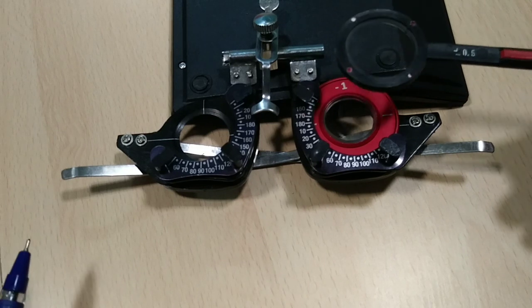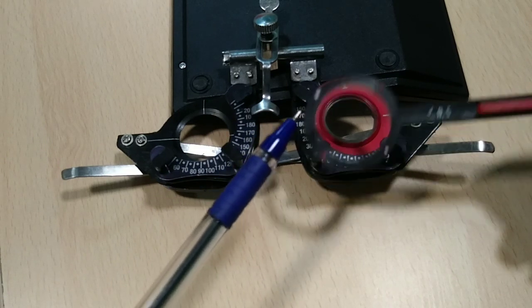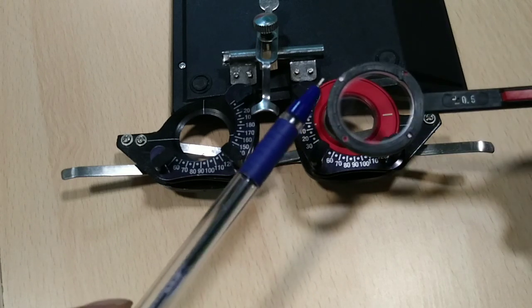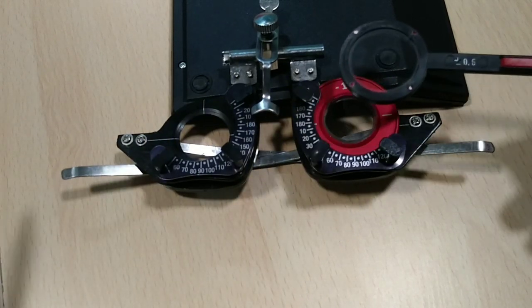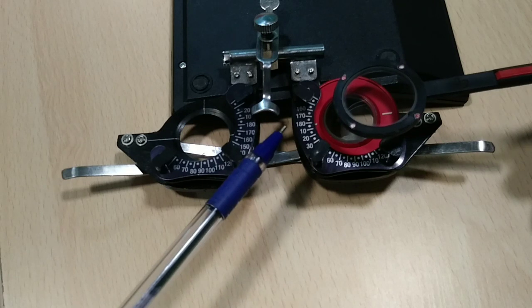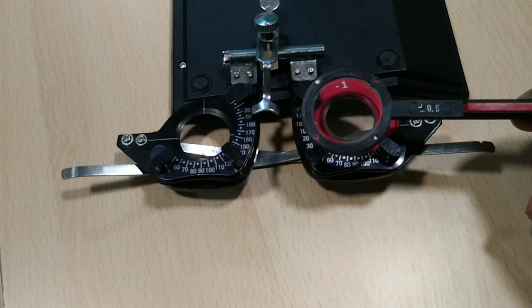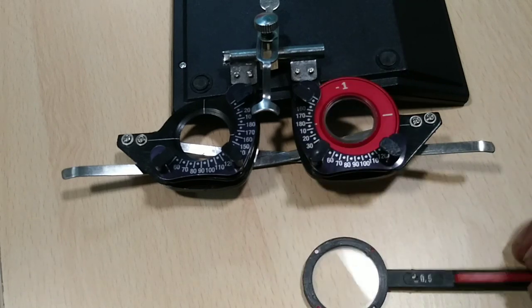To refine the axis, ask the patient which side is getting better. Remember: the white dot is minus and the red dot is plus, and the lens currently placed is the minus lens. If the patient says the white-dot side is better, we have to move the axis toward that side by 10 degrees. For example, if the patient says this side is better, rotate the lens 10 degrees — moving from 180 to 170.